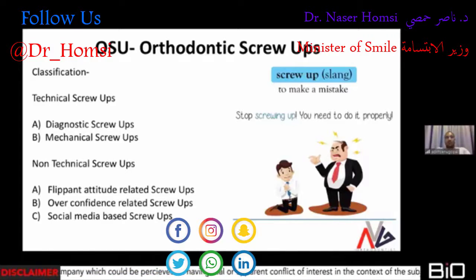Now, mechanical. Why is it mechanical? Because of the various claims these self-ligating brackets have these days, we think we might not need to do the conventional things we do to get a high canine down or to alleviate crowding. We can just put the brackets in, run the wire with very light copper nickel-titanium, and it's just going to take care of itself. That's a mechanical screw-up, which you would actually see after you put in those wires. You might just push all the teeth out of the bone.